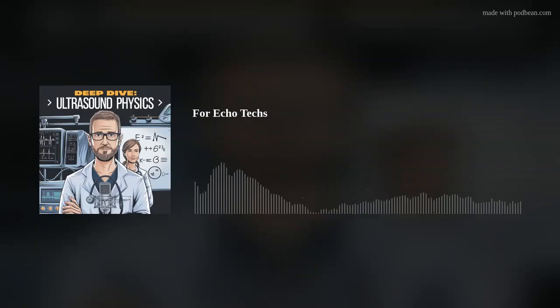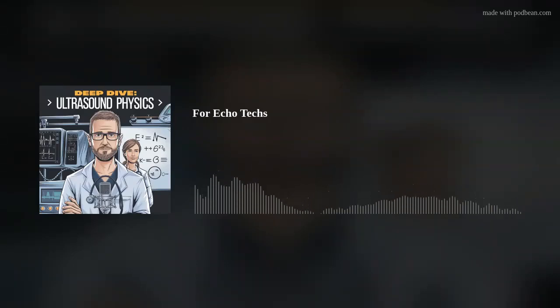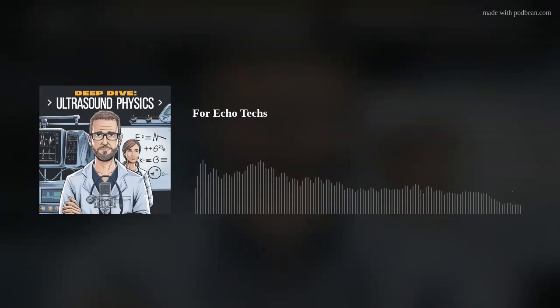You're right. Why the esophagus? That still seems like a weird way to look at the heart. I know it sounds counterintuitive, but remember, the esophagus sits right behind the heart. Oh, that's right. So by putting the probe there, we get much closer to the heart and avoid interference from things like ribs and lung tissue. So we're basically getting a backstage pass to the heart with TE. Exactly. We get a much clearer view.